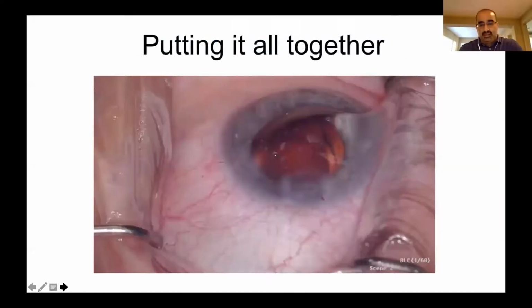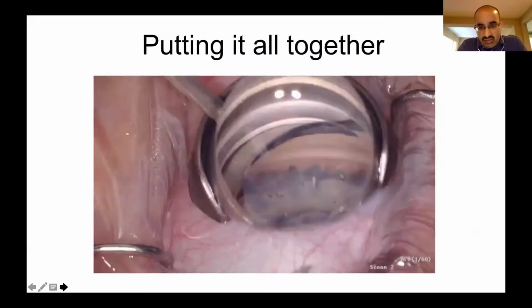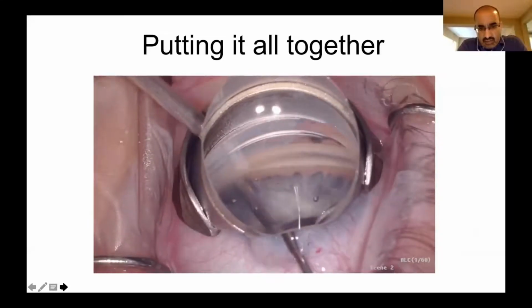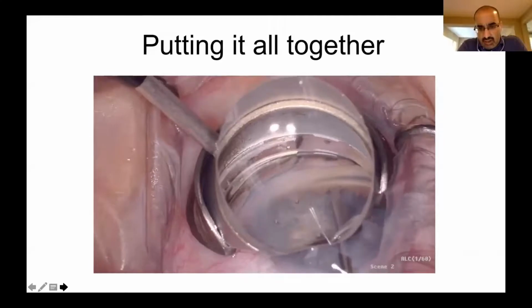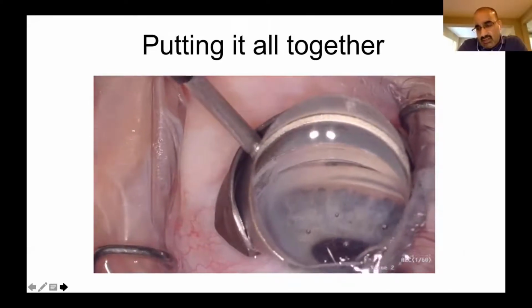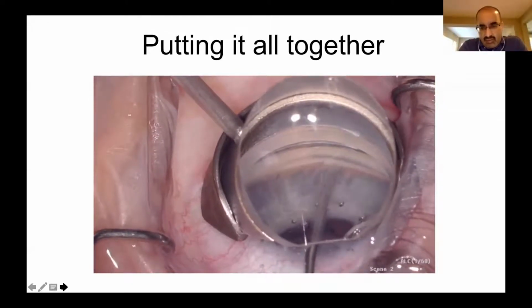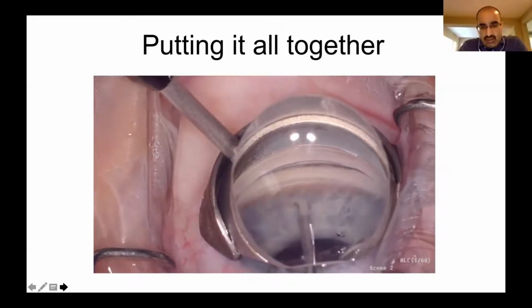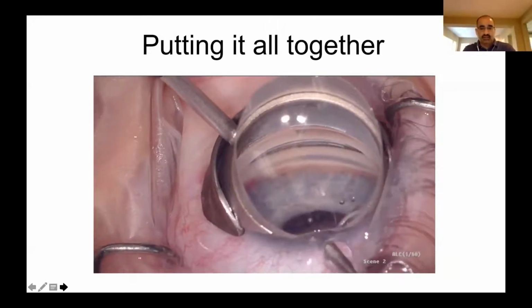And this is putting it all together. What you're going to see here is a goniotomy procedure. This is a device that I had a hand in developing with New World Medical. It's basically a device that goes in and strips the trabecular meshwork. You see here a movement from left to right, followed by repositioning to the right-hand side and moving right to left. And you can see stable eye, stable movement, good view. What you're getting here is a decrease in intraocular pressure by removing the trabecular meshwork entirely.